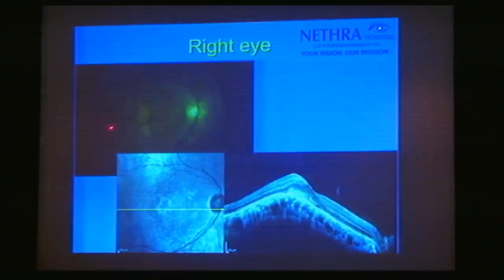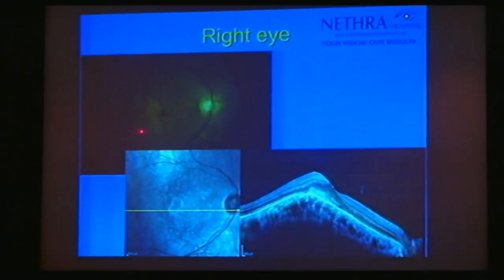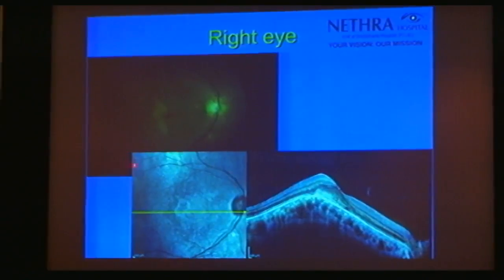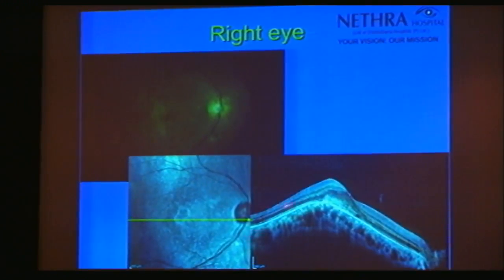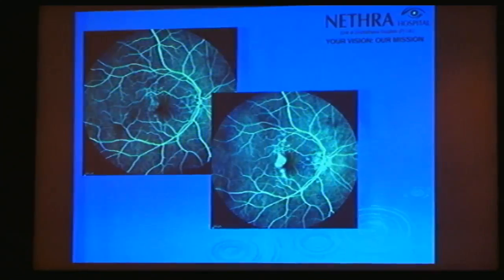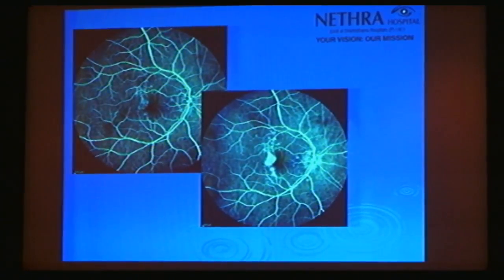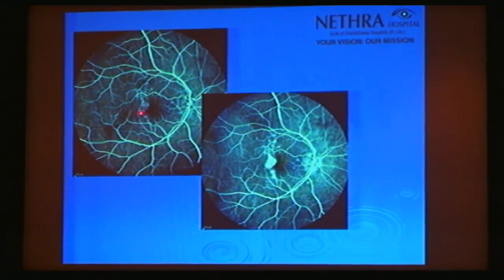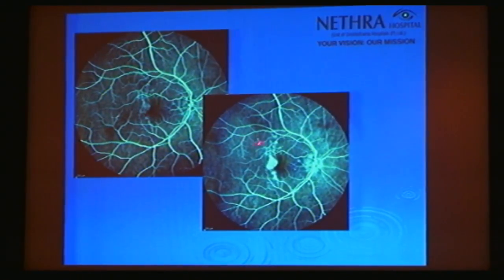The fundus examination shows a tongue-shaped hypopigmented lesion in the juxtafoveal region with a few punctate lesions superiorly. OCT shows a dome-shaped macula with subfoveal CNV. Fundus fluorescein angiography in the early phase shows a few leakage, and in the late phase shows increase in intensity of the leakage.